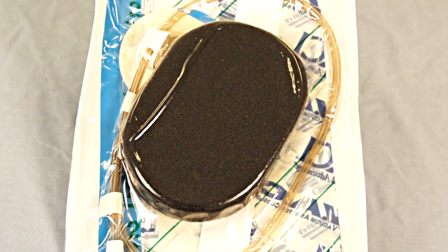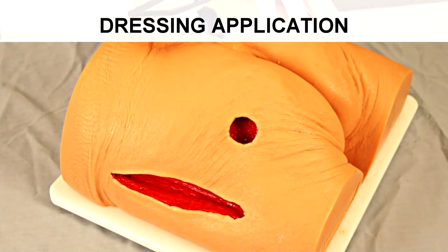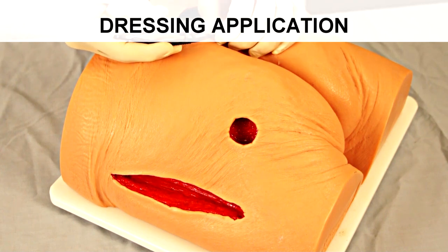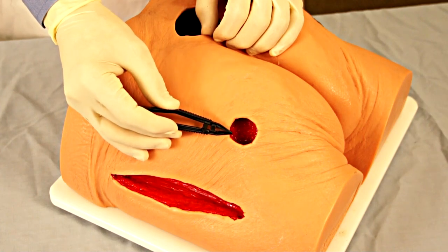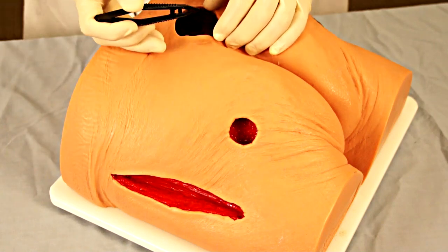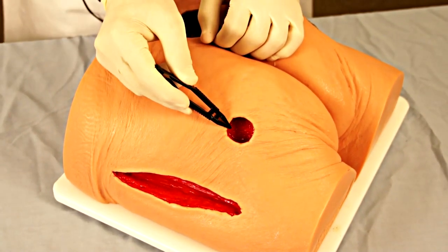Once you have selected the appropriate size sponge based on the wound defect to be filled, you can then open the packaging and proceed with application of the dressing. This demonstration uses an artificial wound model supplied by KCI. We are seeing here that this patient has an ischial ulcer that is a stage four ulcer. There are muscle fibers present in the base of the wound.